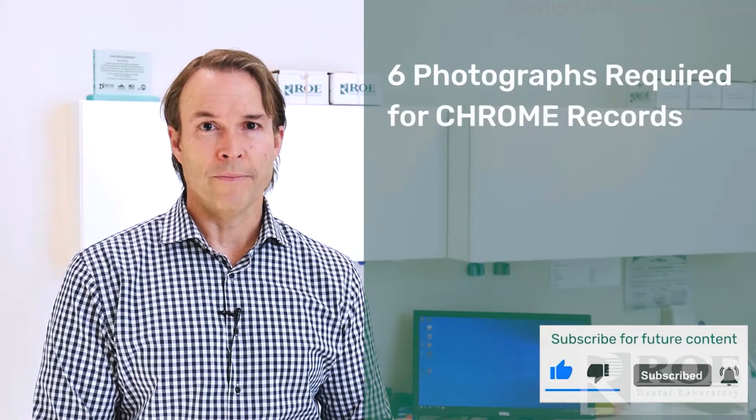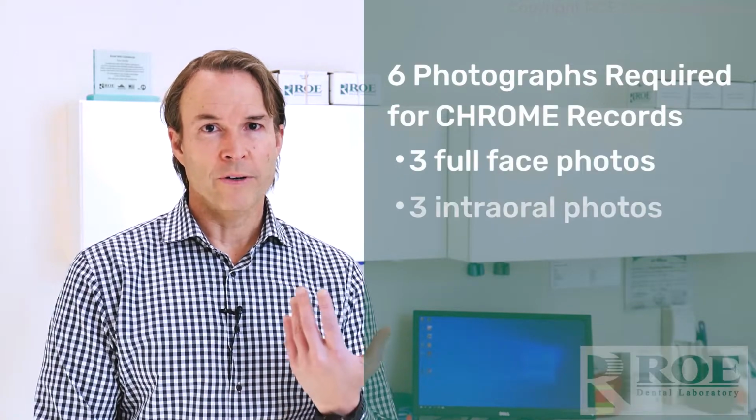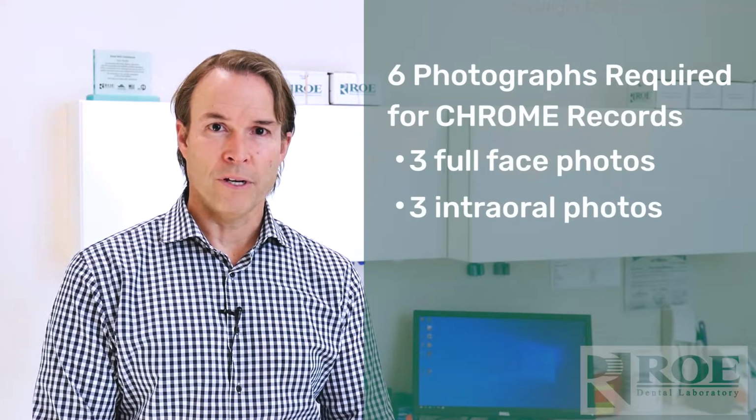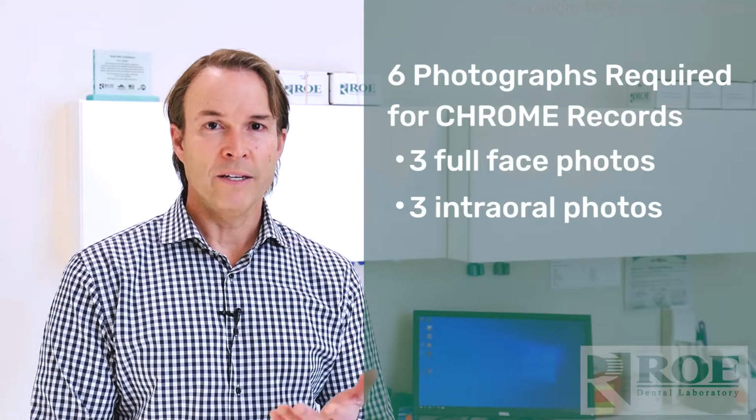In this video, we're going to describe the 6 photographs that are required for Chrome Guided Smile. 3 are full face, 3 are intraoral. We'll capture each one and we'll discuss a little bit about the picture itself, why we take it, how to take it, and then we'll discuss some pitfalls of dental photography.